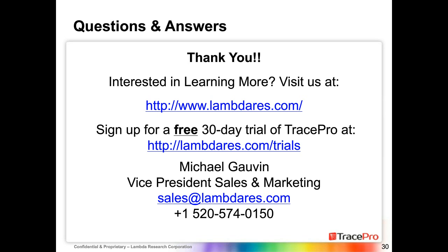And another similar question, I'm going to skip around in this list of questions here, but does TracePro have a realistic built-in skin model? We do have an example that you can download that has everything preset in terms of thicknesses and everything else that you can go through as an example, but it also has a full catalog of different types of skin tissue in terms of epidermis, dermis layers, and things of that nature. And you can create your own. It's very, very simple to custom create your own catalog by just entering the anisotropy and the scattering coefficient of the particular tissue and then saving it with a name to be used for later on. Okay.